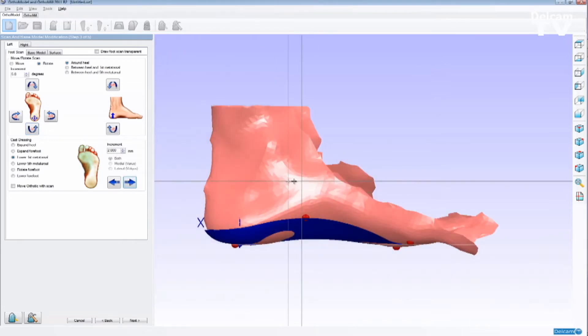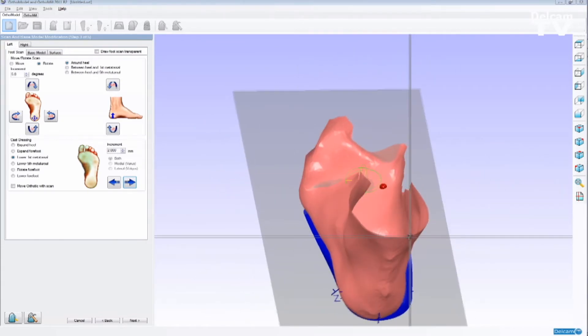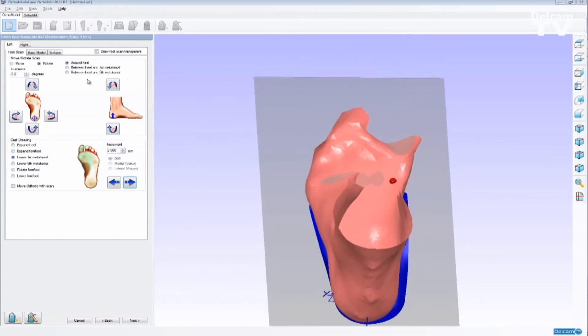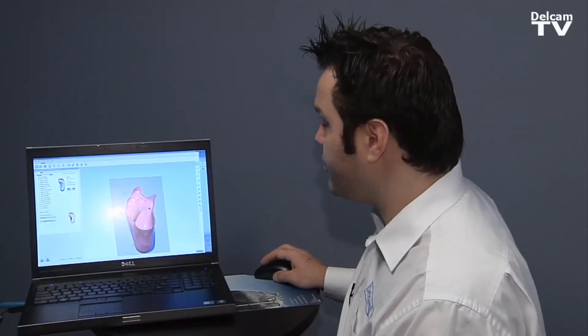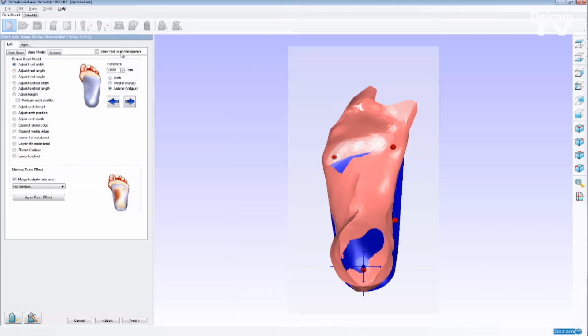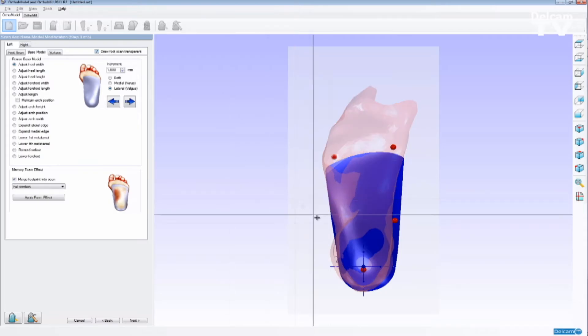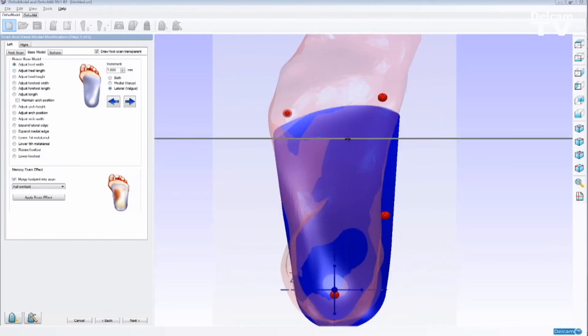So if I'm happy with the modifications, I can proceed to the next step, which is to change the orthotic shape. We can view the foot scan transparent, and we can analyze how the orthotic has been designed.